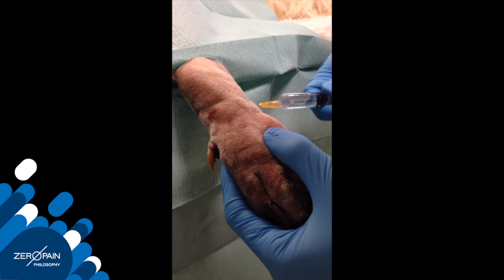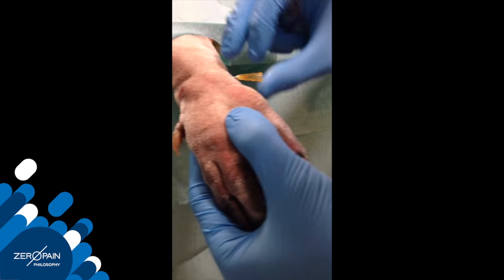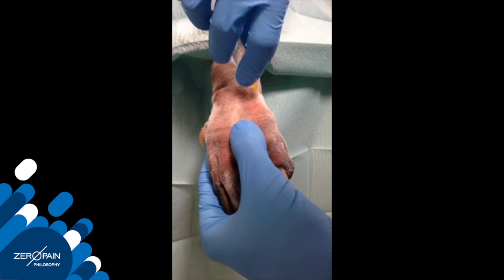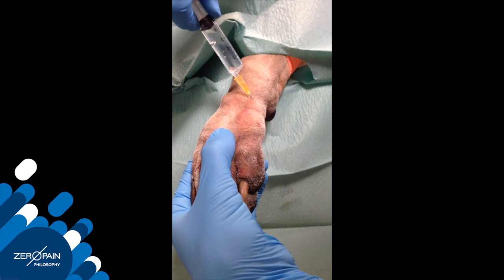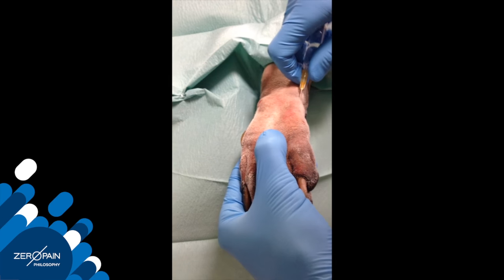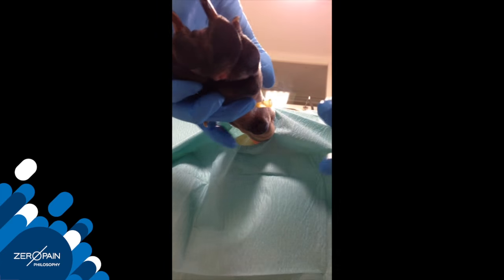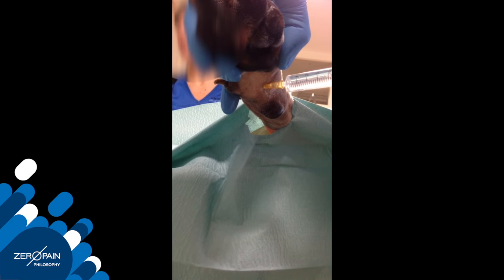A short needle is inserted subcutaneously through the skin perpendicular to the long axis of the limb, and this is repeated on the opposite side of the limb. 0.5 mls local anaesthetic solution is injected at each site and then the needle is redirected and the injection repeated. This process is continued until local anaesthetic is deposited around the entire circumference of the limb.